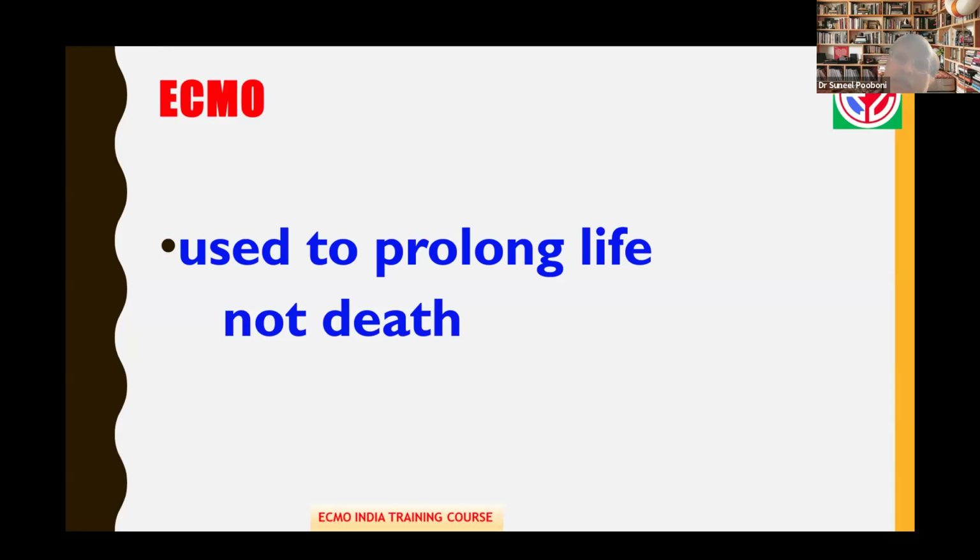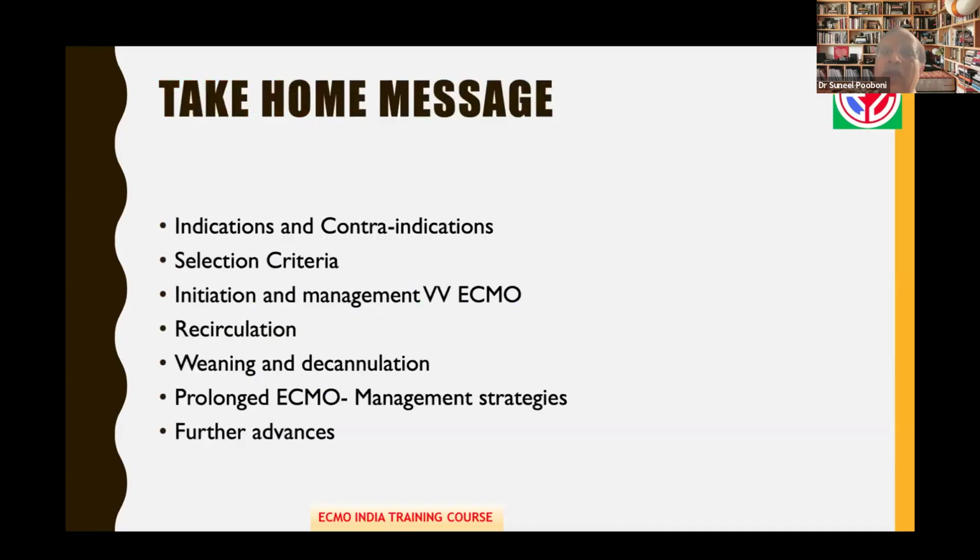In those cases, one has to take a decision about stopping the therapy. If ECMO therapy by itself, such as continuing heparinization of the patient, is likely to harm the patient, then you have to take harder decisions of coming off ECMO and continuing them on ventilation only.